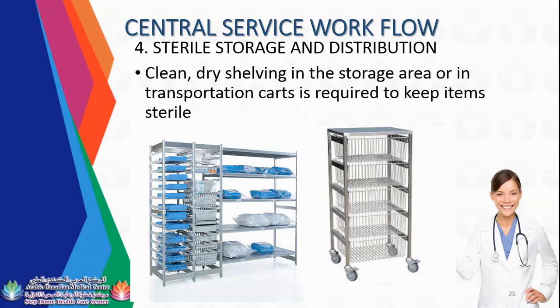You can transport instruments in different ways. Some are using a transport bin. Some you can manually carry. Once you do the manual carrying of the instruments, you need to keep the instruments away from your body.